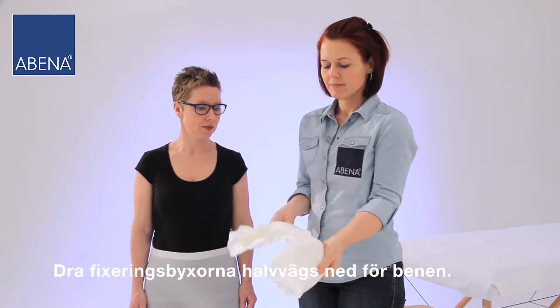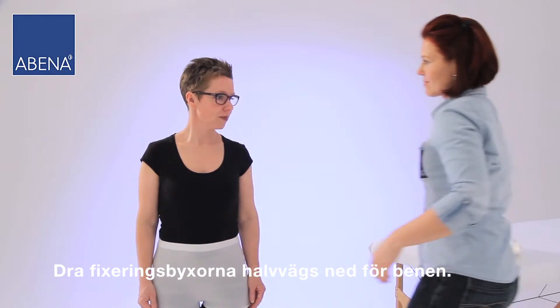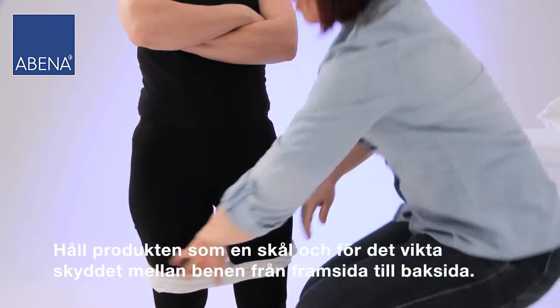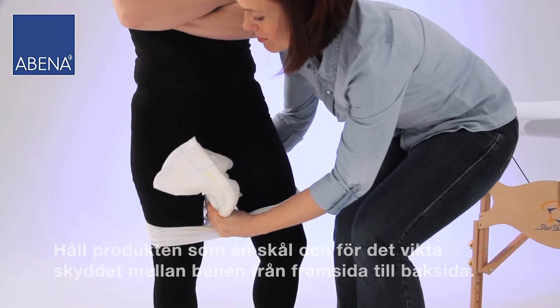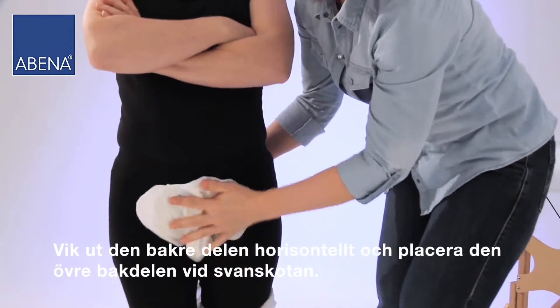Pull the fitting pants halfway down the legs. Hold the product like a bowl and pass the folded pad between the legs from the front to the back. Fan the back of the pad and position the upper rear end at the coccyx.